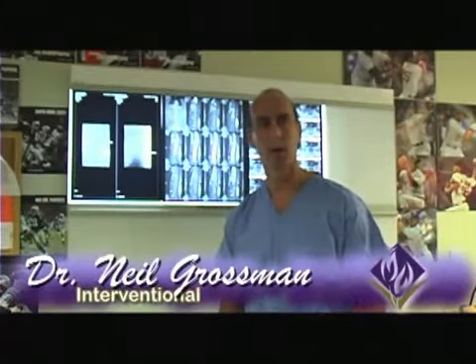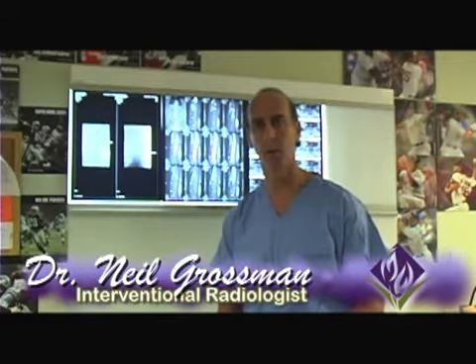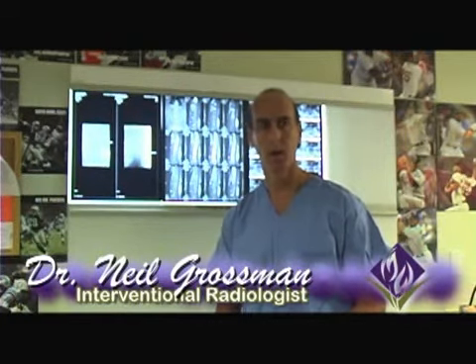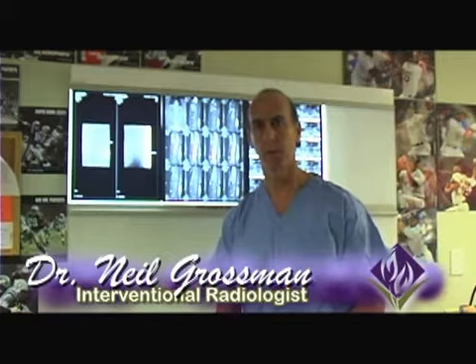Today we will be performing a kyphoplasty procedure. Kyphoplasty is performed for treatment of patients with back pain related to either a subacute or acute compression fracture. These fractures typically occur as a result of osteoporosis, but the treatment can be performed on patients who present with malignancy or traumatic fractures.